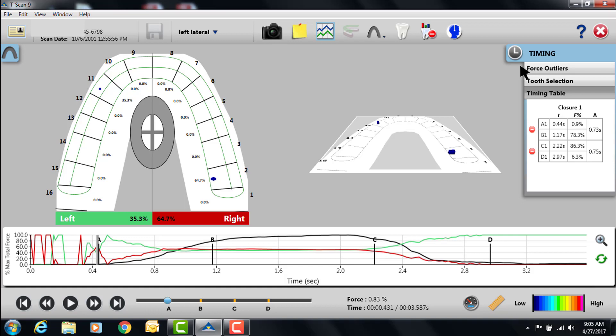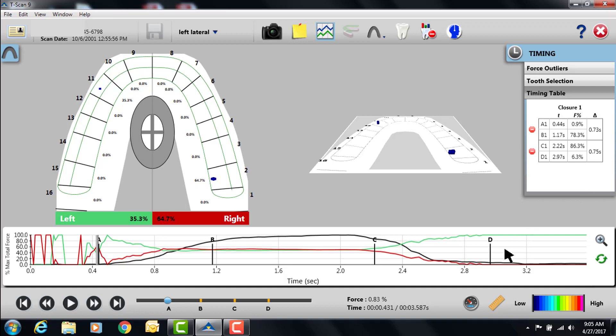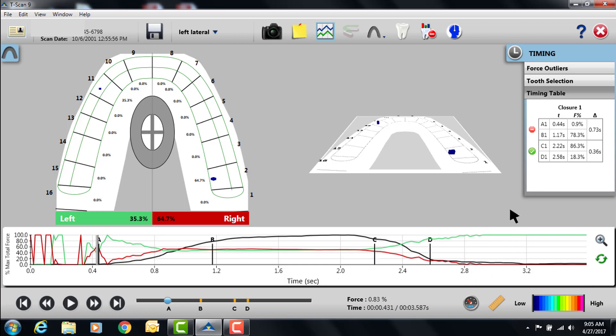If we open our timing table here, we can get a quick identification of where we are between C and D. Currently, you can see that the C1, D1 lines show a difference between about 0.75 seconds. Ideally, we would like this D line to be closer, which you can see that a green check mark occurs, which would imply that the patient's excursive movement does not have as many interferences which can cause challenges during the excursion.